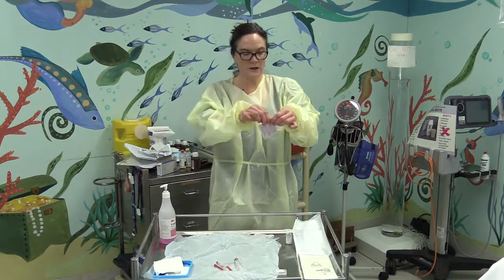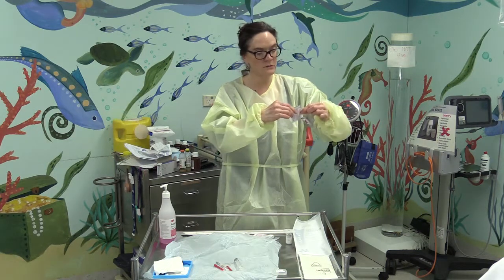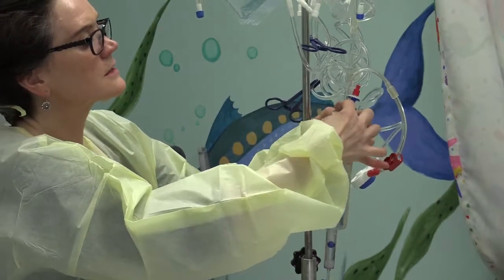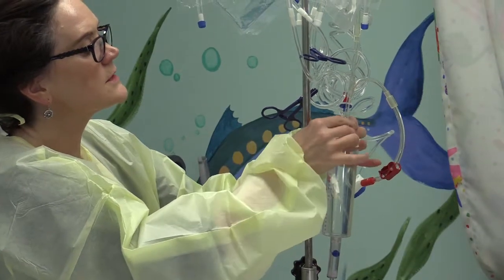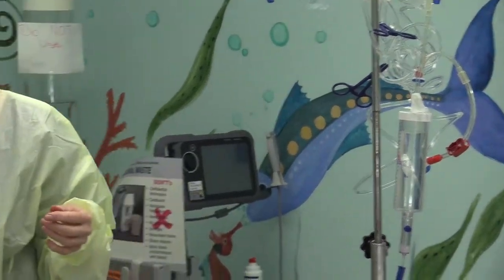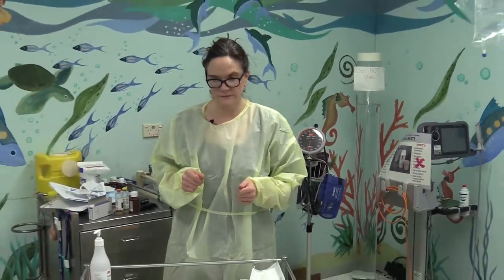Then I'll open up my alcohol wipe and cover the injection port of the burette and wrap that so that it's completely covered and protected from the air and droplet bacteria while I'm washing my hands. I'm now going to wash my hands for 3 minutes and don some sterile gloves.